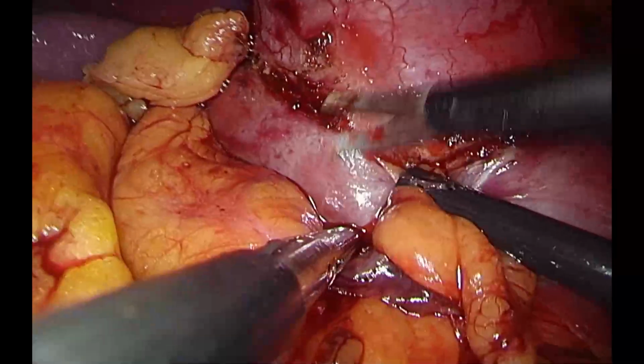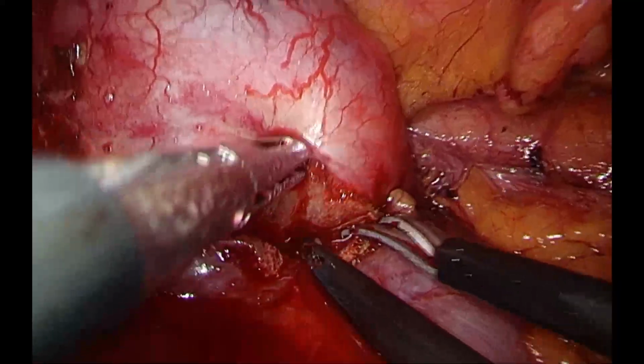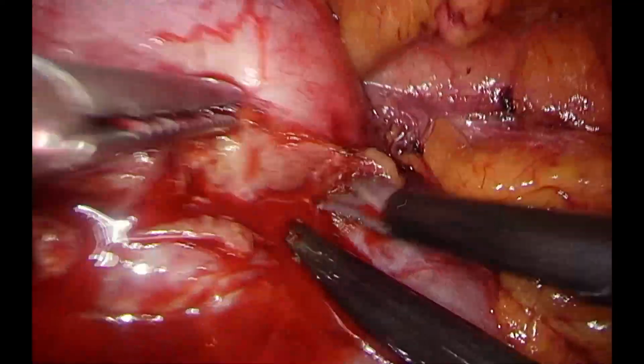The tumor was excised with careful identification and preservation of the collecting system, and hemostasis was secured.